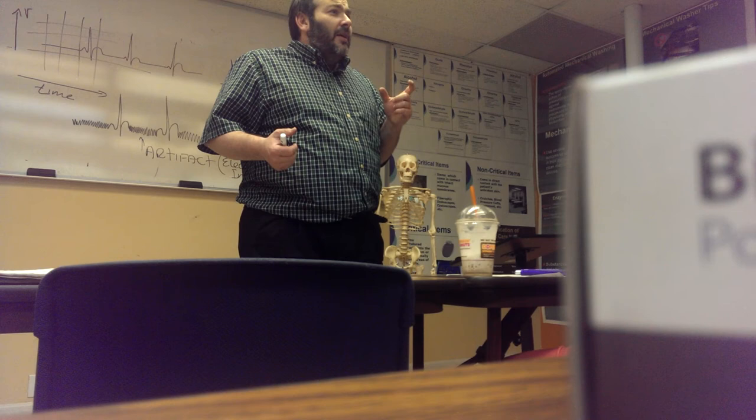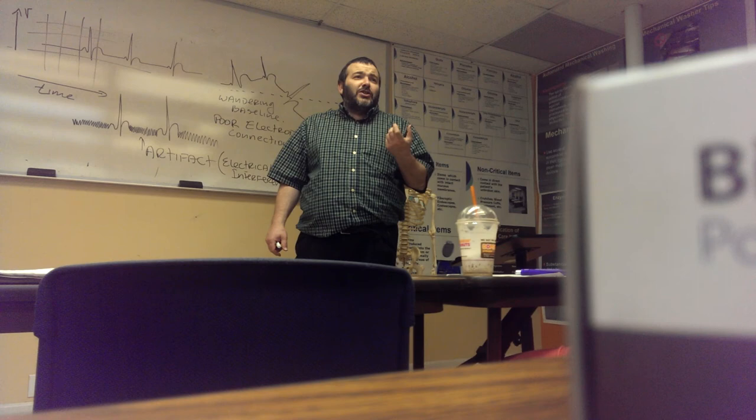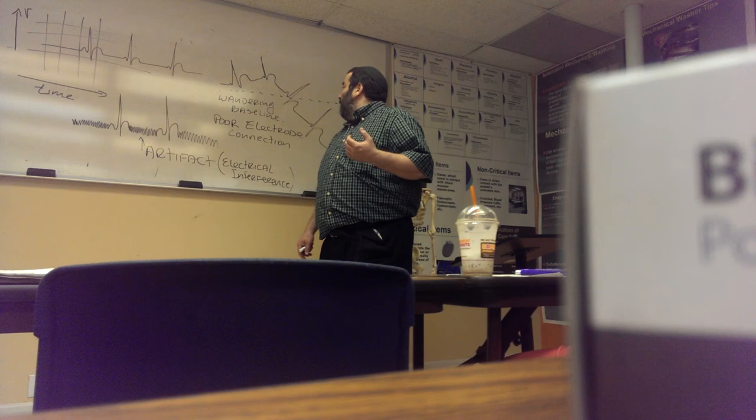But don't you yourself answer calls and text while you're doing an EKG. I mean, that's not professional at all, so don't do that. So this is called artifact, which means electrical interference.